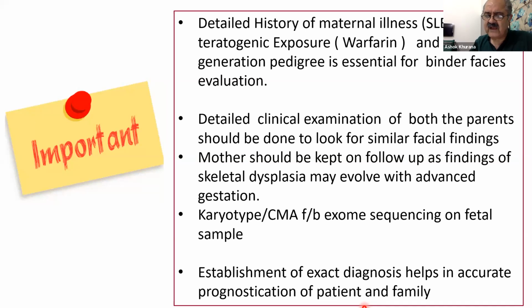Yeah, but I think this gallery of patients with which to show them, and to show how some look completely normal, particularly from the frontal aspect, is really very useful. The most gross aspect is from the side aspect, but a frontal picture is very encouraging. You are not going to diagnose a Binder's by frontal, isn't it? You have to do a frontal. No, I'm talking about to guide them later, sir. Later, how will they look?